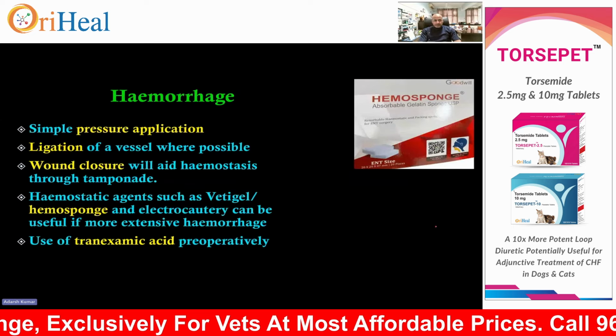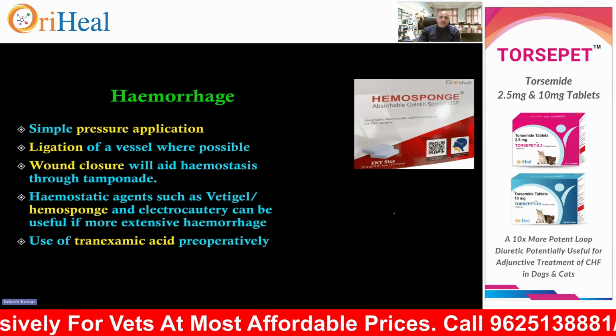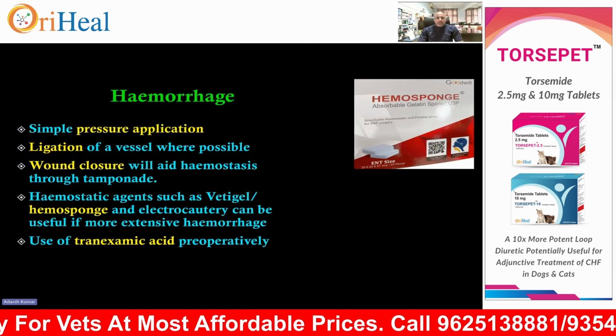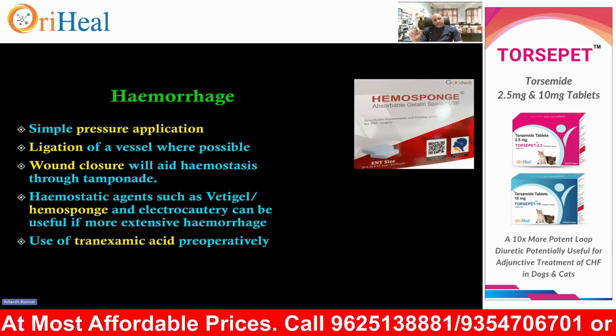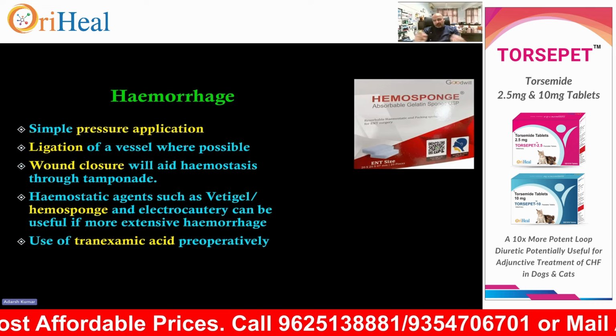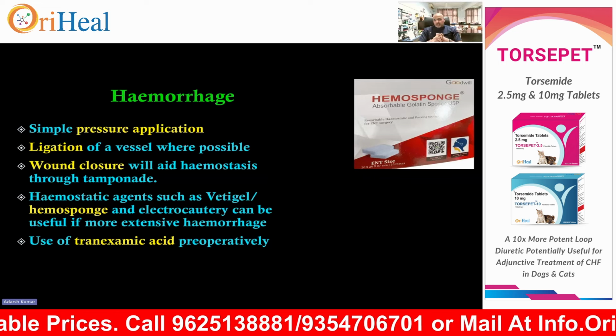If hemorrhages are there, hemorrhages do occur. So simple pressure application you can do. If you see a bleeding vessel, you can ligate it. You can use the cautery also, right?